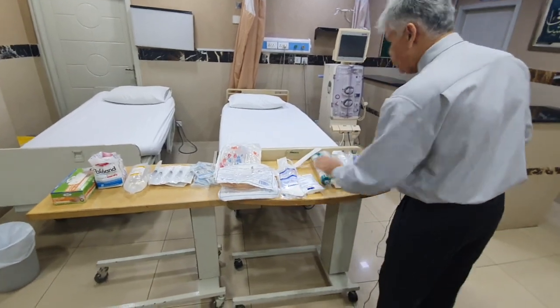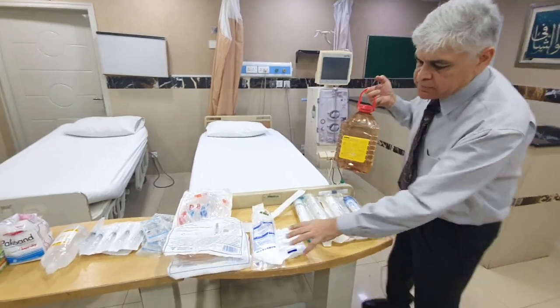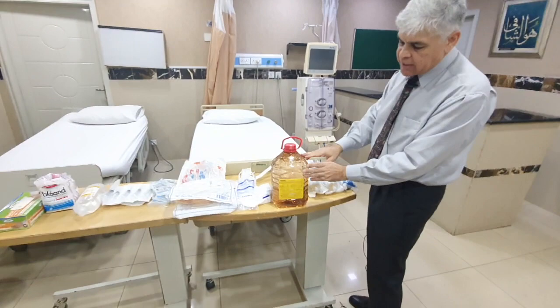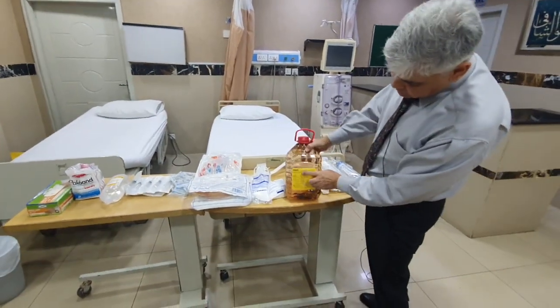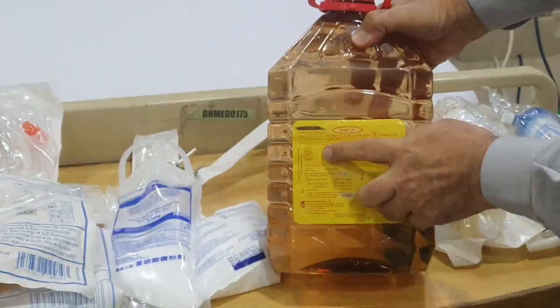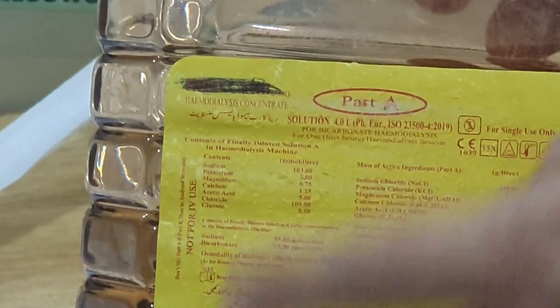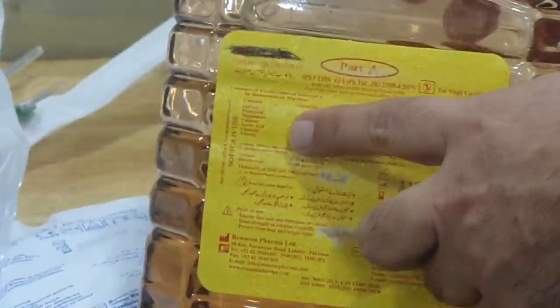Now this bicarb is normally added with this one. This is an A part, what we call. So this is an acid part, and the acid part in itself has got different numbers here. For any dialysis machine, in any dialysis procedure, you need to look at these. You can get some low calcium fluids, you can get some high calcium fluids, you can get some low potassium fluids.